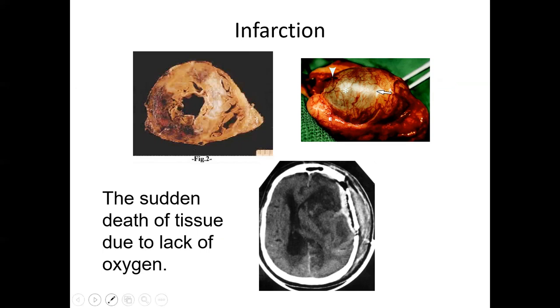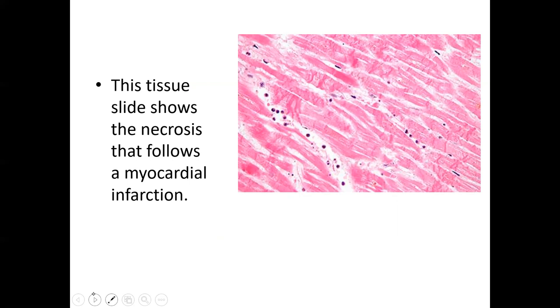Here's this necrotic tissue from a myocardial infarction. You see these little cellular debris and junk out here.